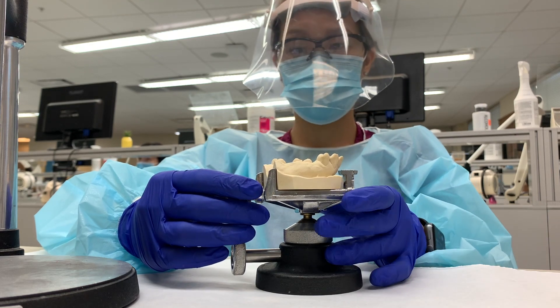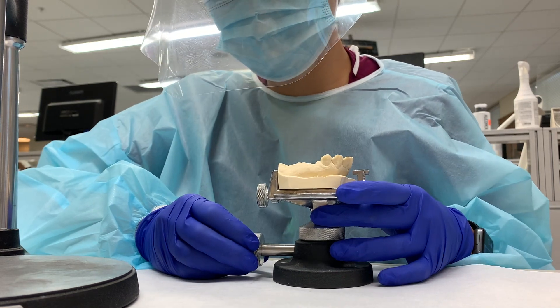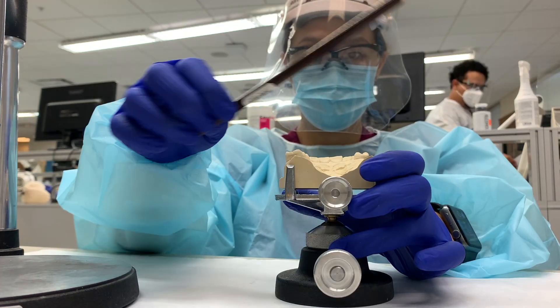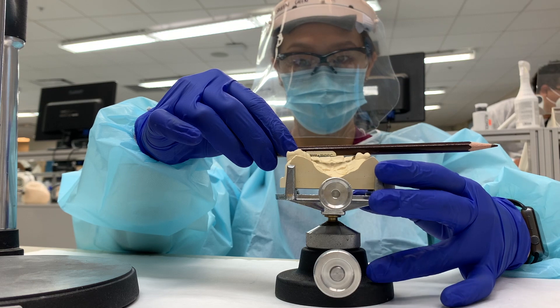I just placed it on the bottom and adjust it to try and get it relatively flat in terms of the occlusal plane. You're going to find guiding planes. If you remember, the guiding planes are the proximal surfaces.